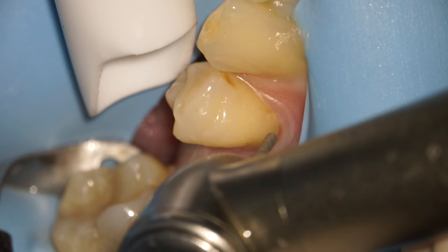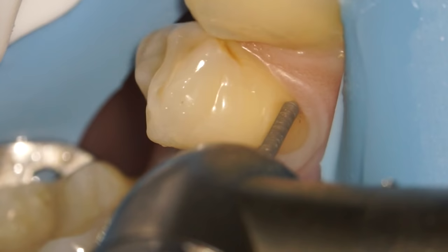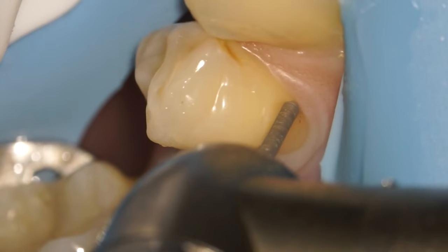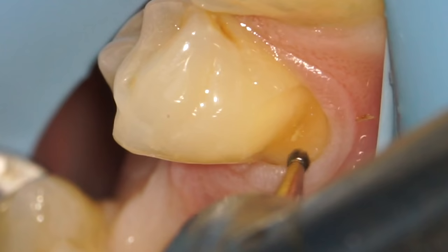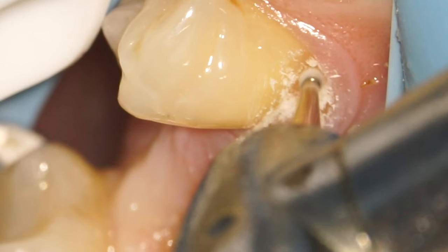We are going to go ahead and try to fix this problem. The first step is to remove all of the old white filling material that the last dentist had put in. It takes a while to get it out, but once we do we expose what's underneath. You'll see there's a soft, cottage cheese appearance to the decayed tooth structure as we remove it. It's critical that we get it all out so that no bacteria remain and cause further problems.